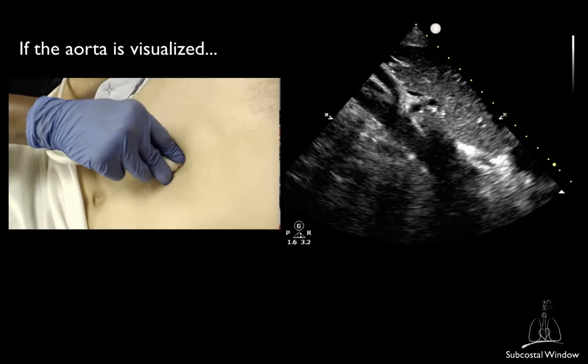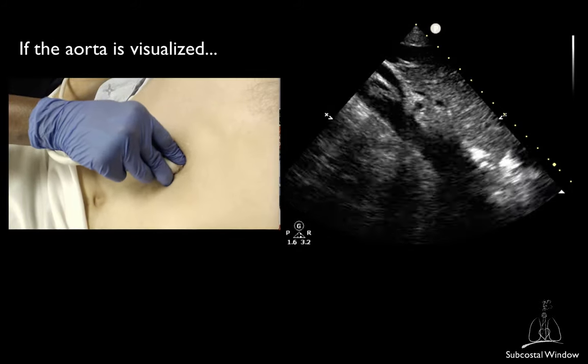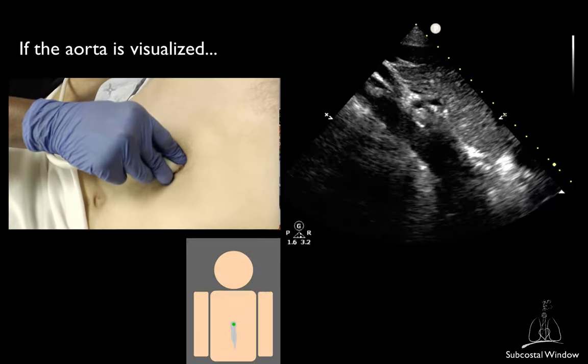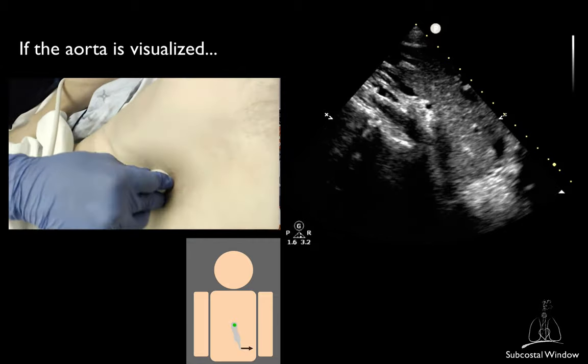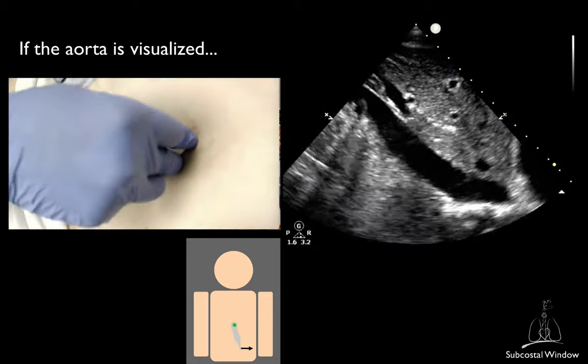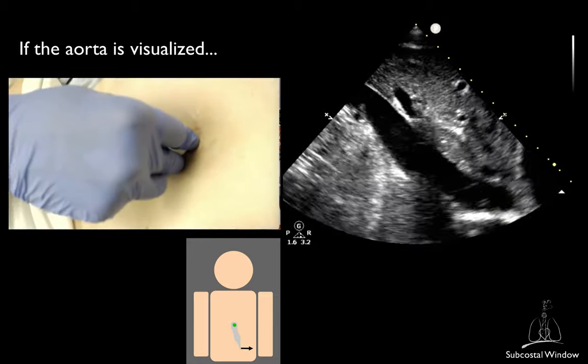If, when rotating, you image the descending aorta, just tilt the footprint towards the patient's right, which should enable you to get the IVC.